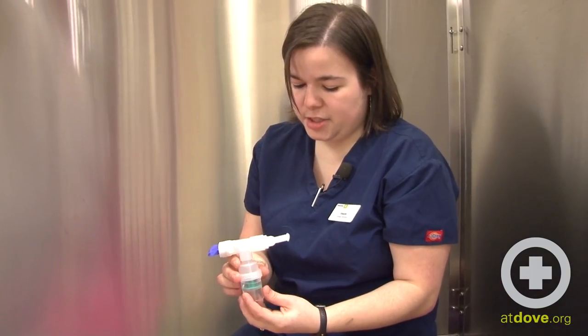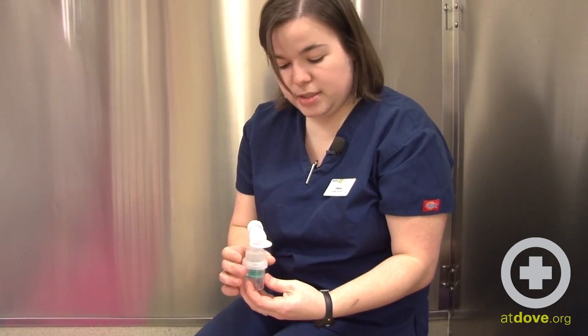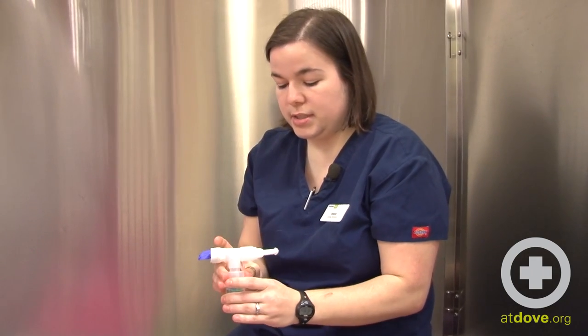This is my little nebulization unit that I have pre-filled with saline. This patient doesn't need any additional medications with this nebulization. We are just using saline and oxygen to run through so that he can stay on oxygen while he's receiving his treatment, since he is oxygen dependent.